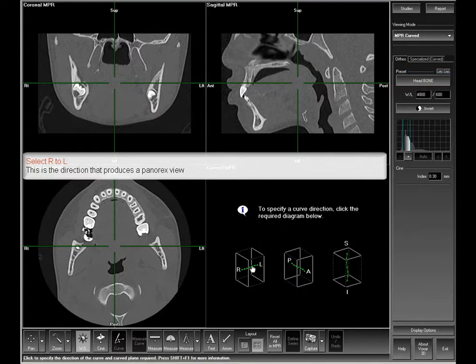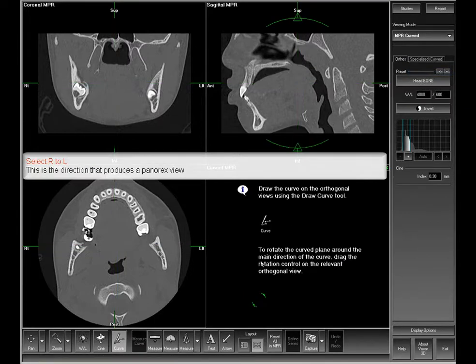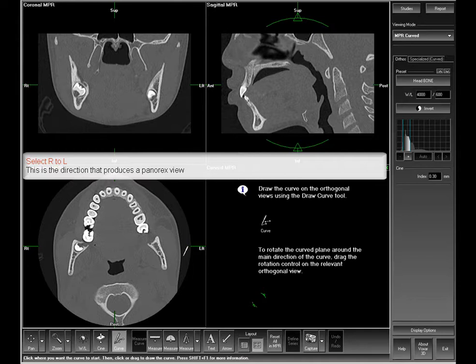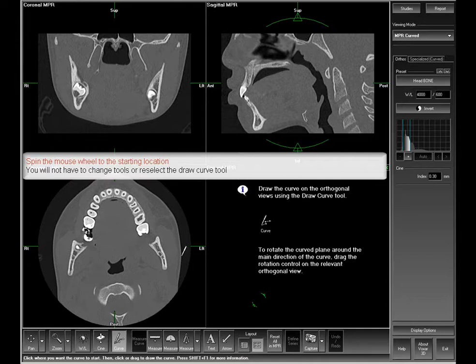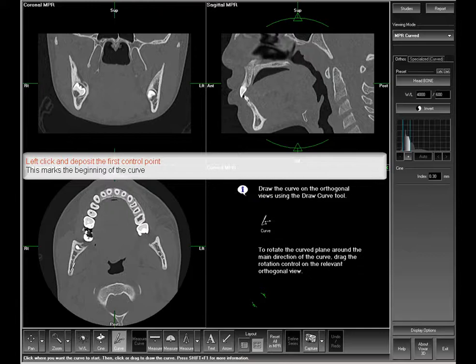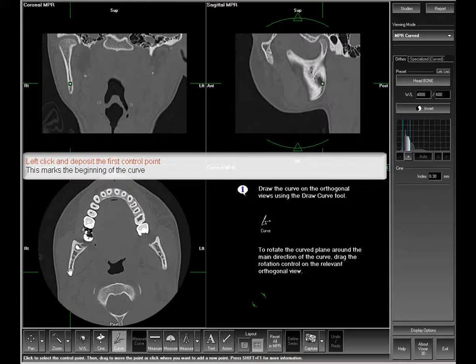Select right to left as the main direction of the curve from the specialized fourth view. Spin the mouse wheel to the ramus of the mandible. Left click and deposit your starting control point.